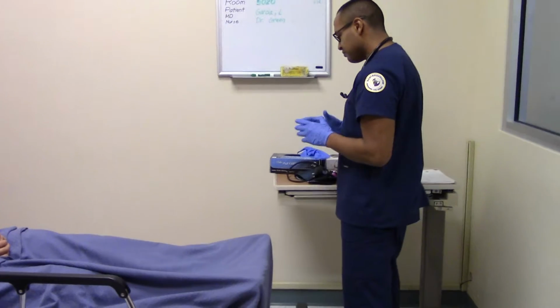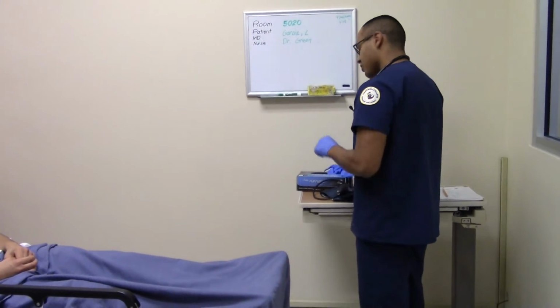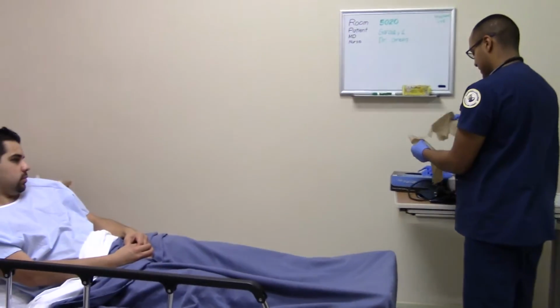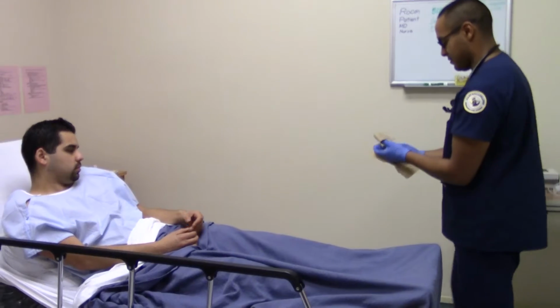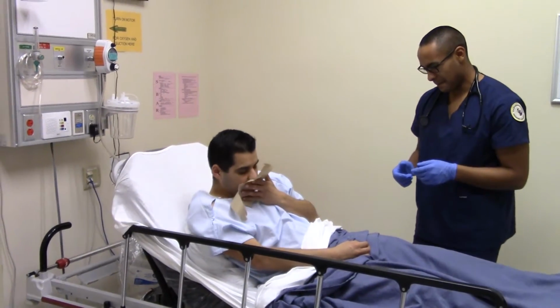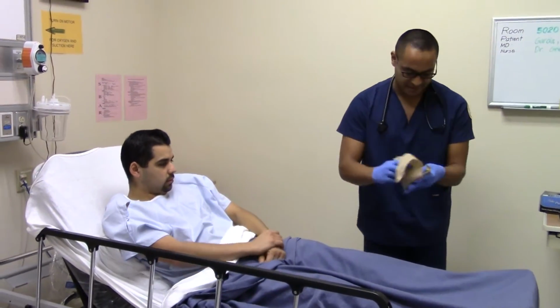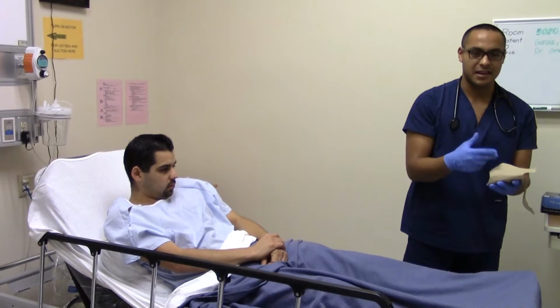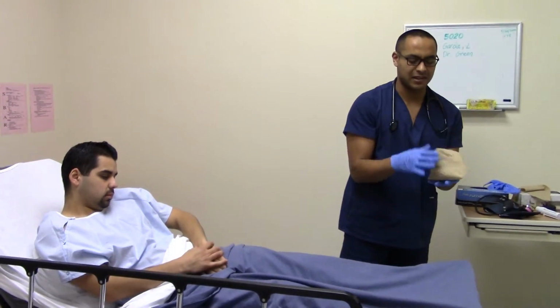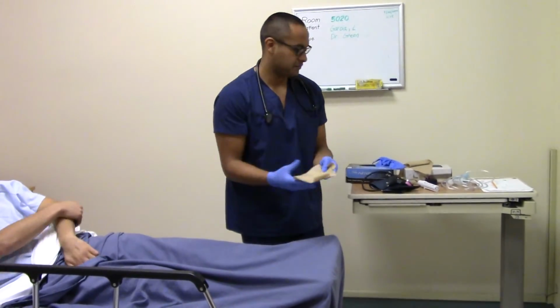Okay, I'm going to have you cough. I don't even feel like it, but go ahead and try. You're breathing better, which is good. Nice. I look at the color, any hemoptysis, any color, viscosity, amount. I look at that right now. Just letting you know what I think when I see the sputum.